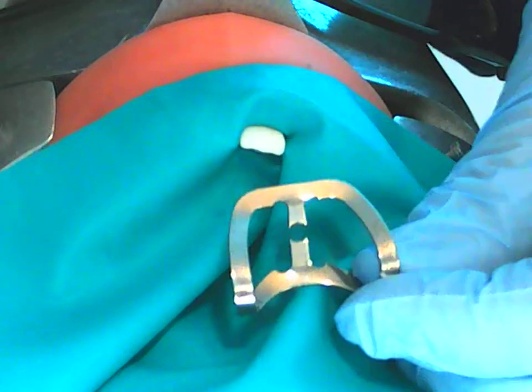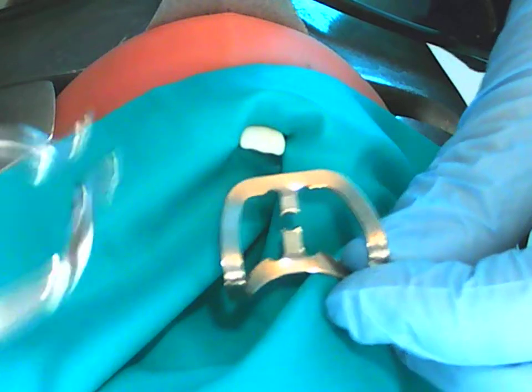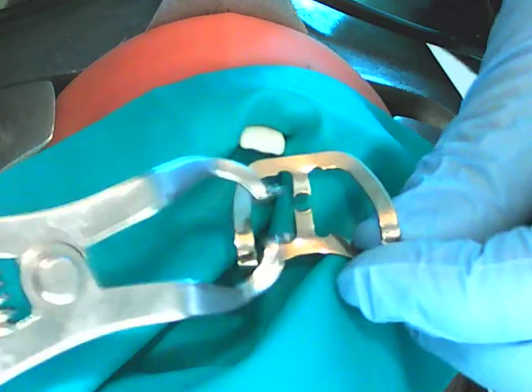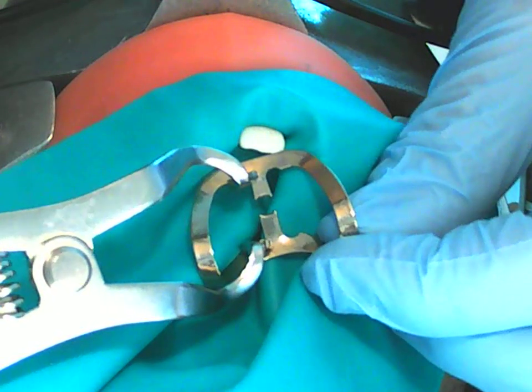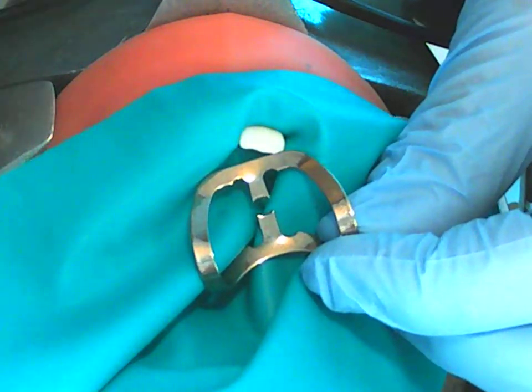Okay, you're just going to let go of that for now. You're going to get your clamp ready. You're going to orientate yourself to this clamp again. Okay. Long side, short side. Long side, you're going to put your beaks right in those little grooves of the clamp.